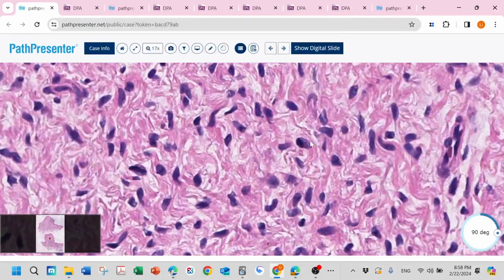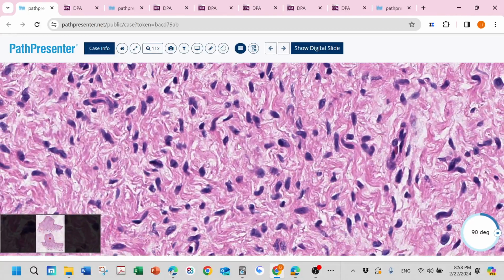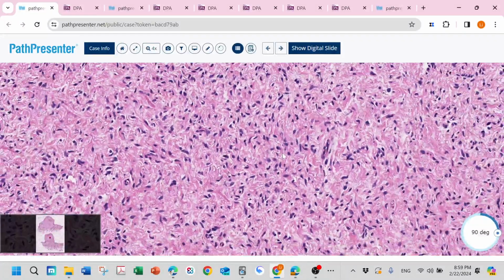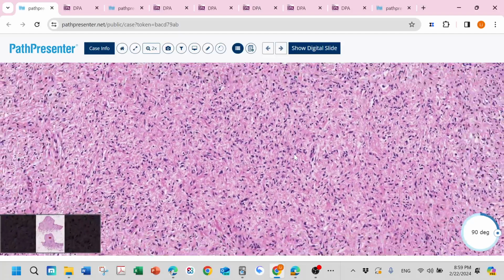This is mast cell, because for this pale looking stroma, neurofibroma usually has this kind of myxoid material. Anytime when you see myxoid mucin area, you will see mast cells. So what are the components of the neurofibroma?